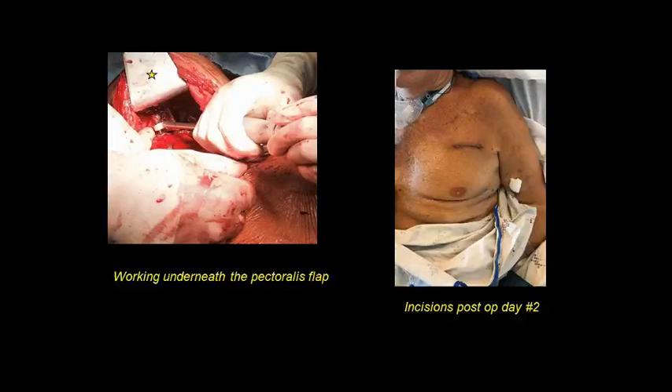Here are some pictures: on the left, a scapula retractor underneath the pectoralis with a right-angle drill placing screws into what I think was a fourth rib fracture anteriorly. On the right is a patient where we repaired ribs two through five anteriorly on the left side — you can see the small subclavicular incision and the inframammary one.